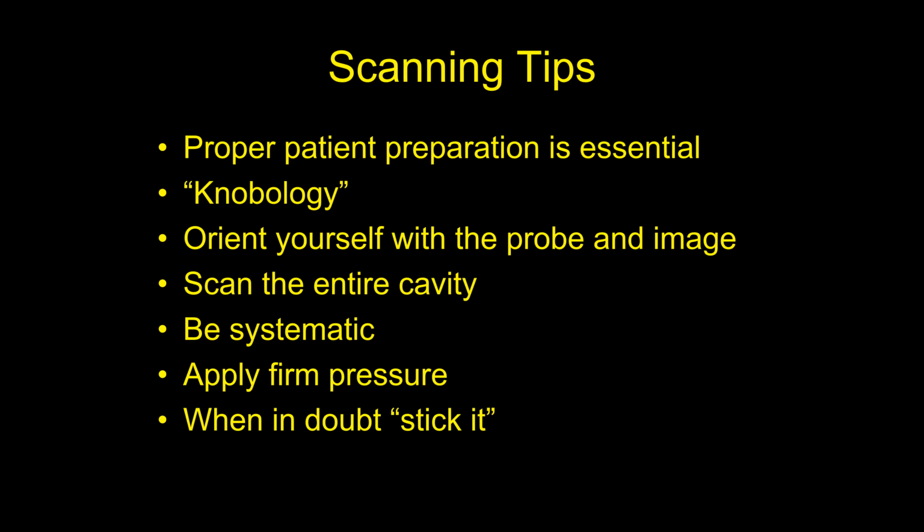You also want to scan the entire cavity for the most part. So if you have an animal that comes in and it doesn't feel right and he's vomiting, and you palpate a mass in the spleen on your physical exam, yeah, you're going to look at the spleen and confirm, do you feel a mass in there, and what that mass looks like. But I think it's also important, because we are veterinarians and these are animals that can't talk to us and can't say what hurts and how long it's been happening, pretty much every exam you do, let's go ahead and scan the entire abdomen. Let's look at not just the spleen, but the liver and the kidneys and everything else in the abdomen and see if we see something else that's wrong, while you're at it.